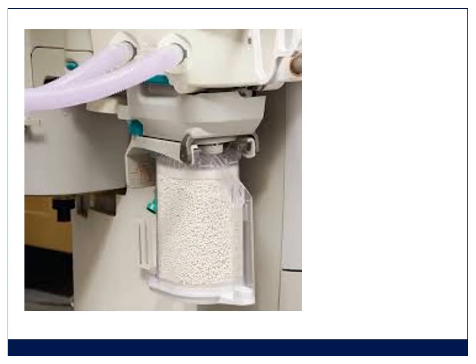Then you need to check your soda lime, your carbon dioxide absorber. It must be securely in place. Again, depending on the system you've got, these often are a cause of leak. They don't sit nicely, or some of that soda lime gets into the seal. It should be nice and white.